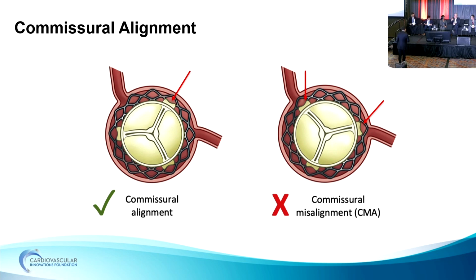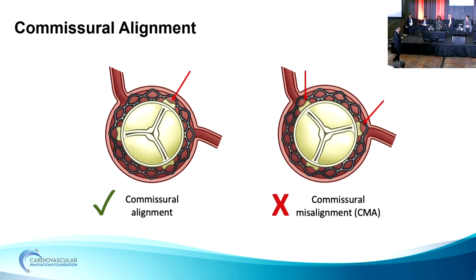Well, that was going to be my question. When you do TAVR, do you have the ECMO circuit all primed and ready to go in the room, or how do you do it at your hospital? So we have the ECMO machine in the room. We don't have the perfusion. So we've converted to an emergency, pretty much like any other coronary case. If we need to put ECMO, we already have the large bore access there. So we actually thought about putting ECMO.